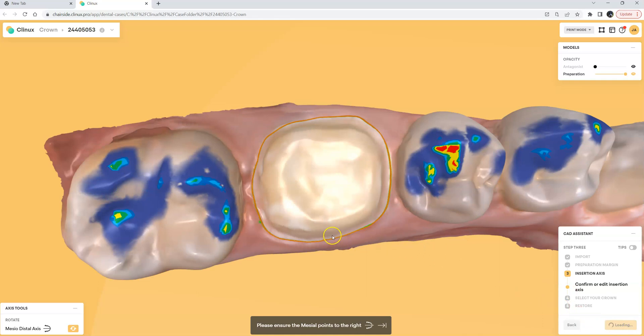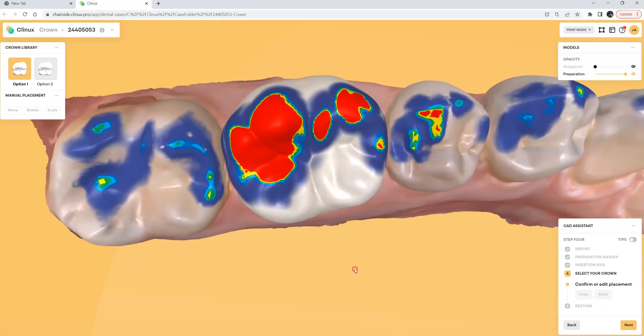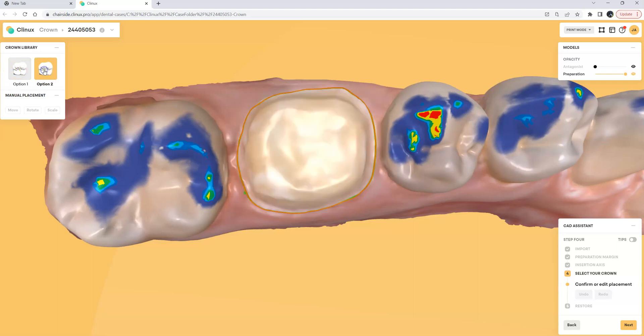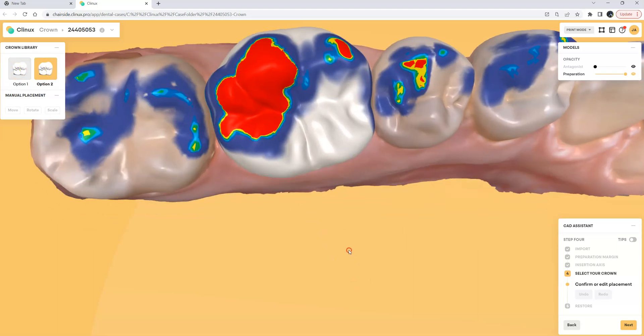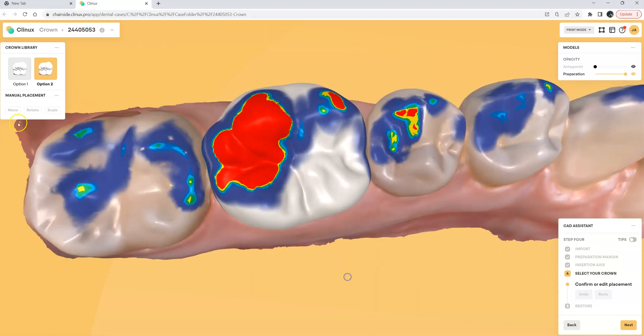Once we click the Next button it'll ask us to do the manual placement of the tooth and there are two different crown libraries for anatomy. We're adding more all the time so I can choose option 1 or I can choose option 2 whichever anatomy design I like best and then what I'll do is go ahead and use the manual placement tool.